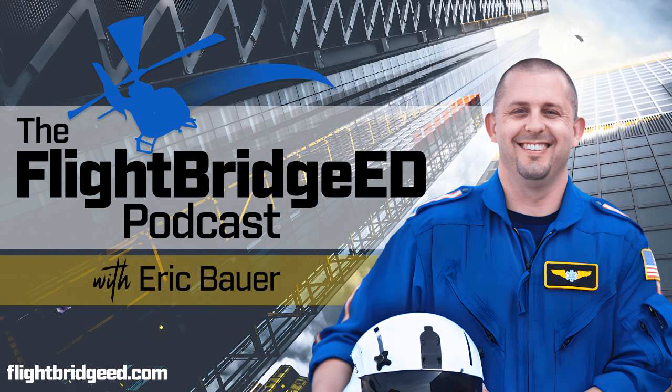So now we have a PEEP of 8 and an FiO2 of 60%. And you're going to keep going back and forth. At this point, you're going to increase your PEEP to 10 if you still have a drop. And you'll have a PEEP of 10 and an FiO2 of 60%. If you do this and you have a lower tidal volume and higher respiratory rate, with a PEEP of 10 and an FiO2 of 60%, you're going to oxygenate your lung fields just fine, and this is going to be excellent for your patient.